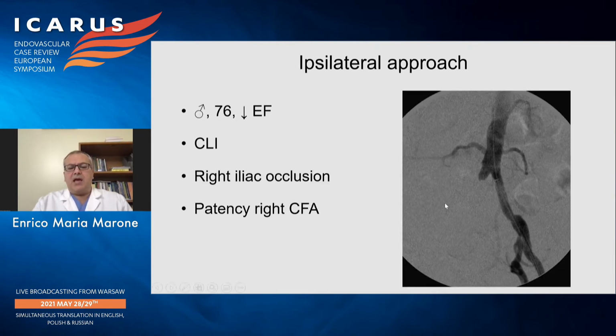But in other cases we can use an ipsilateral approach, a retrograde approach to the iliac occlusion. This is an example.